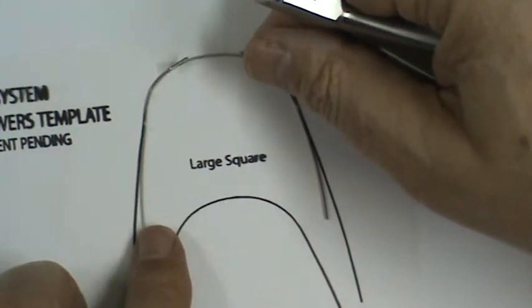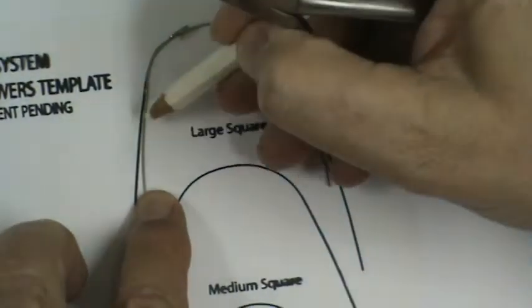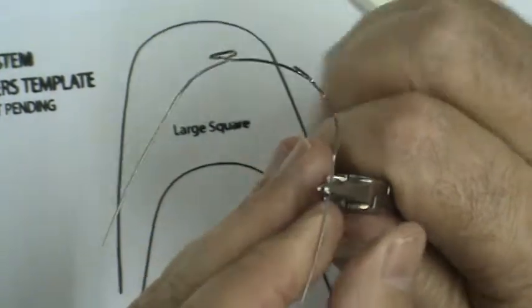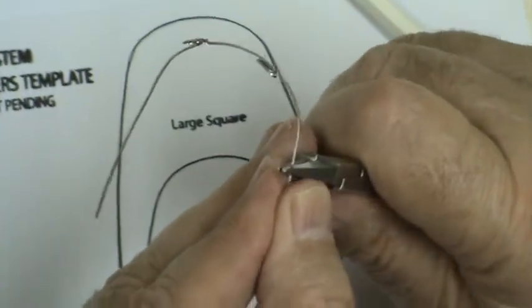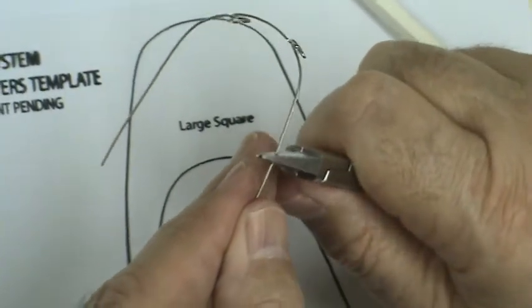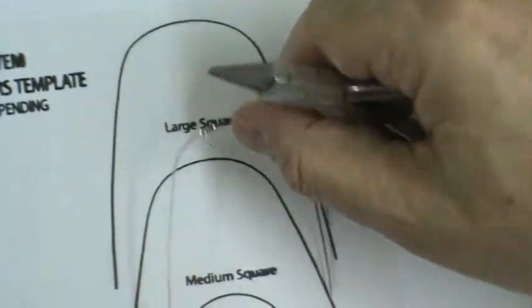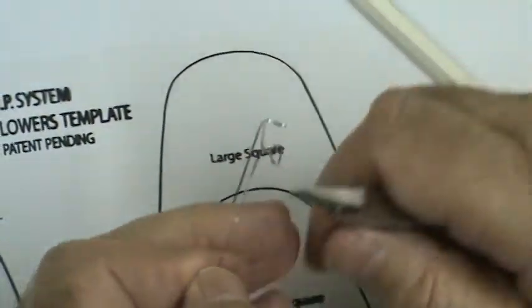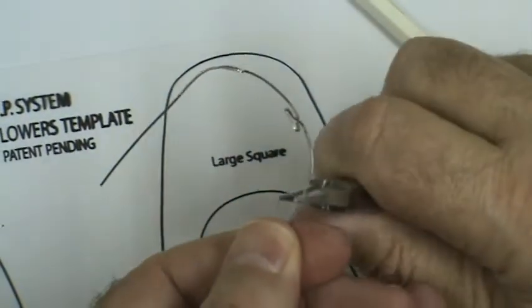And pretty close, but you can see we're still a little divergent, so you may have to just keep working down the wire, making little marks until you get it to straighten out. Just going to work down the wire. Actually, it doesn't really matter if the round end is on the inside or not. So you walk the plier down the wire. This one takes a little more time.